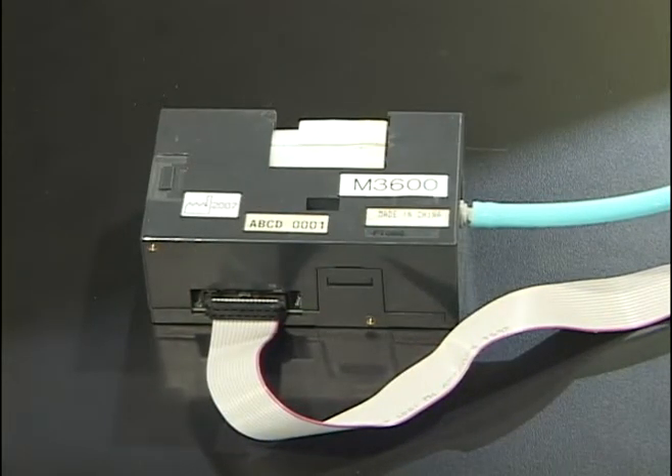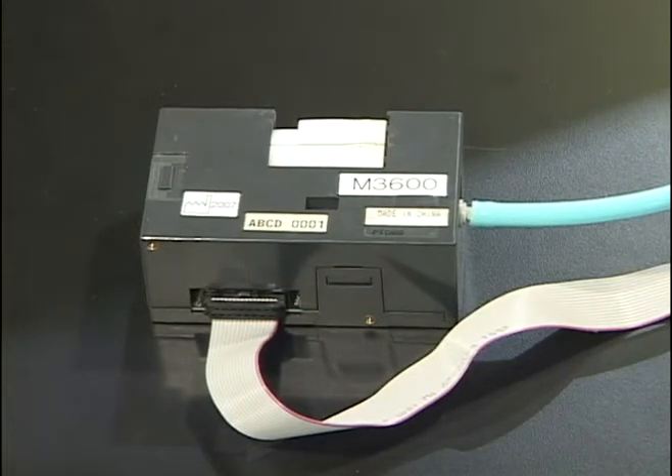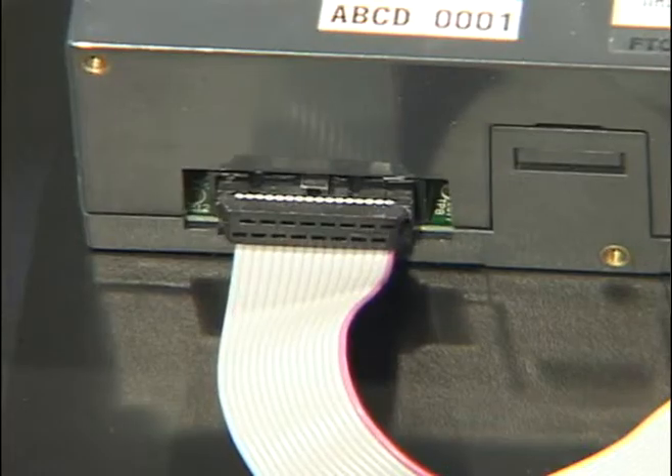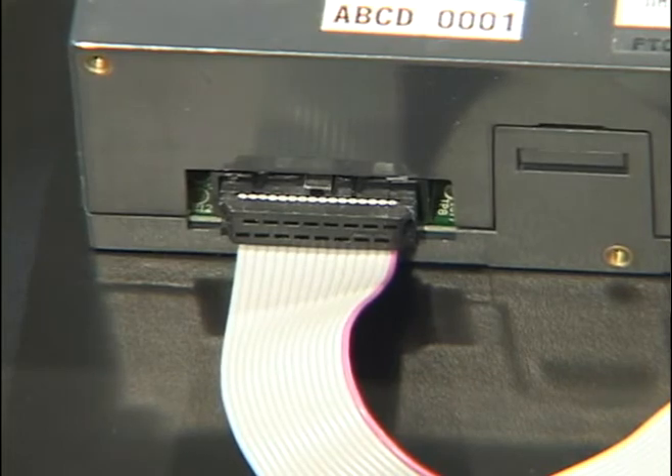This is the M3600 module non-invasive blood pressure device that can be installed in any medical product out there. For companies who don't want to develop their own non-invasive technology, you can simply take this and connect it into your device via an RS232 port, and it'll do all the work — take the blood pressure non-invasively.